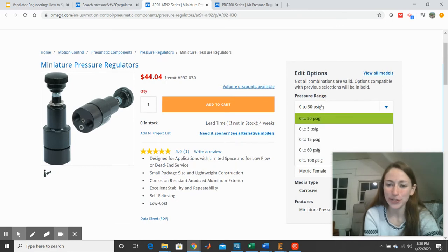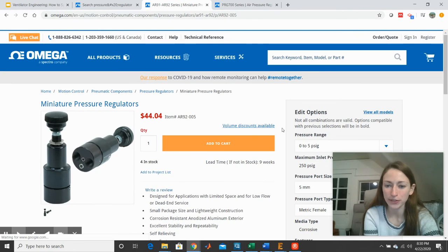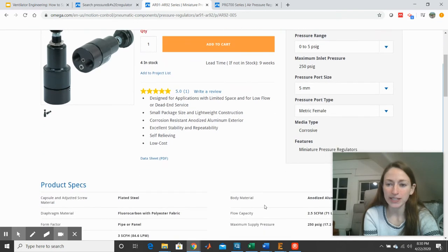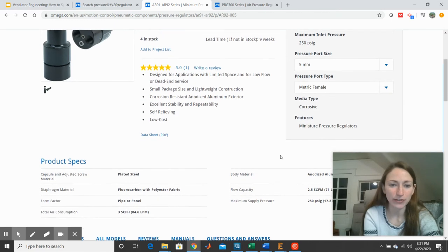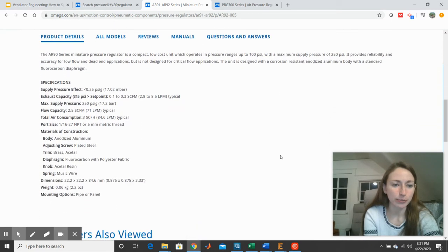So I'm going to drop the pressure range down to the smallest one available, 0 to 5 psi. And happily, these are in stock if they work. I see that the port size is pretty small. I was hoping for more like an 8mm pneumatic tubing type size, but we may be able to work with that if it actually suits our purpose. And then I'm going to scroll down to the product details.